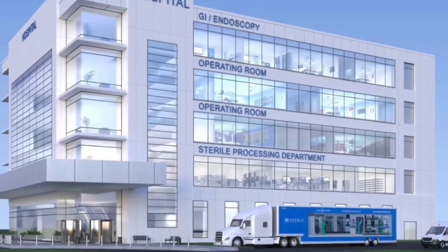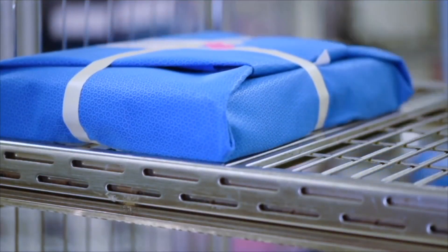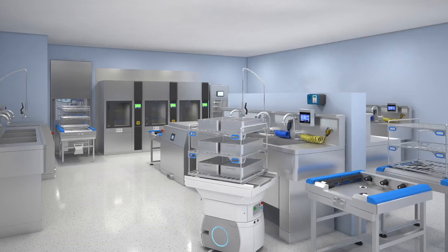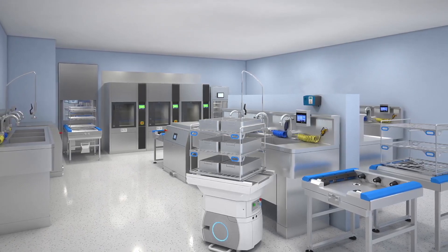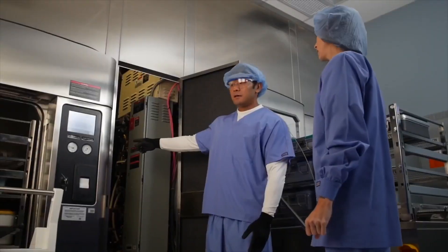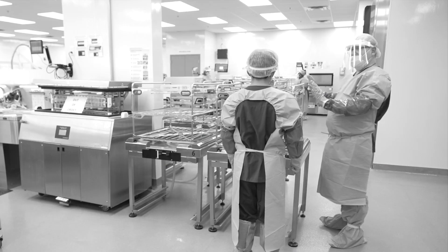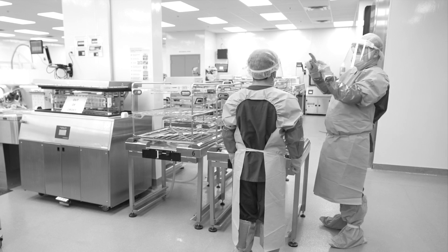Due to their long, useful life, it is not uncommon for facilities to own several different models of steam sterilizers. Over time, chamber materials and chemical cleaners have changed, and so have the recommendations for cleaning found in operator manuals. Therefore, cleaning instructions may differ from manual to manual. In the interest of providing a uniform, up-to-date cleaning methodology suitable for all steam sterilizers, the following procedure may be used in place of methods described in operator manuals.